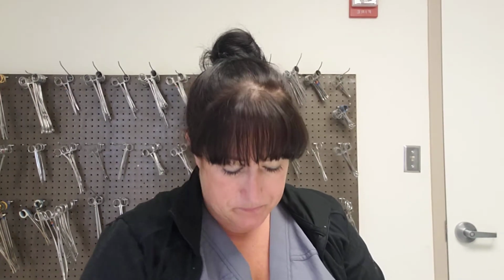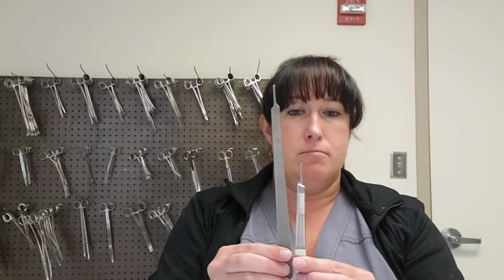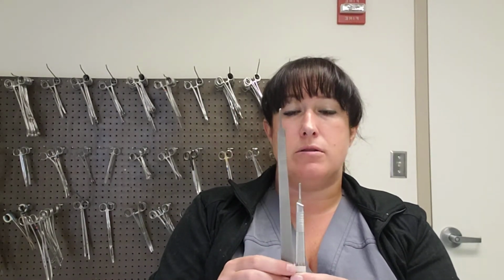The first one is this number 3. There's a number 3 knife handle. There it is. Look, it comes in a longer size, 3 long. You may see this written as like a 3 capital L. But they're the same handle. One is just longer than the other. What makes them the same is this section right here. It fits certain types of disposable blades that you can take off and on here. Okay?